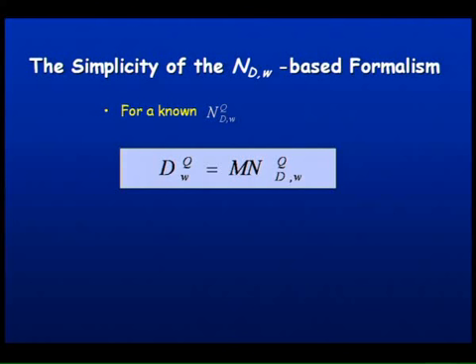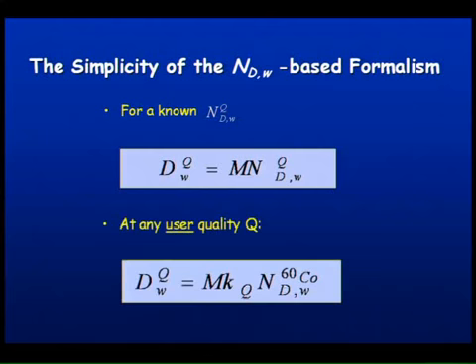Now, until we have NdW calibration in accelerator beam quality, what we have right now is cobalt-60 machines at the ADCLs, and they are the ones providing NdWq calibration at cobalt-60. So when the calibration measurements are done in a cobalt-60 beam, but you want to calibrate your beam at 6 MV or 18 MV or electron beams, then this is the dose equation that is used for the determination of dose.